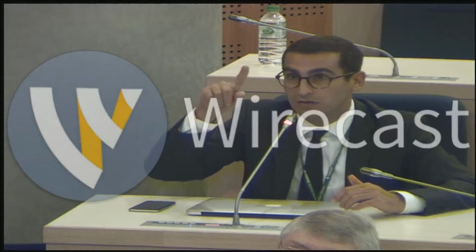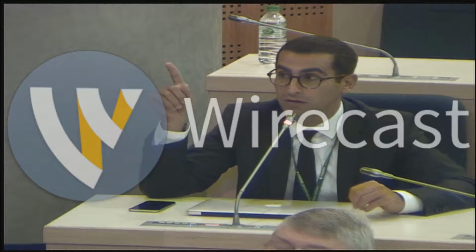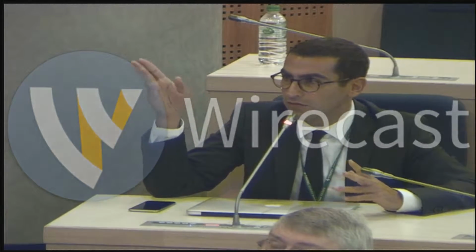And for beginners, when the case is sometimes difficult, you can use a grasping knife like the clutch cutter. There are other tools like that, grasping knives, because it's quite safer. Even if there is fibrosis, you can grasp the fiber and gently make the section.